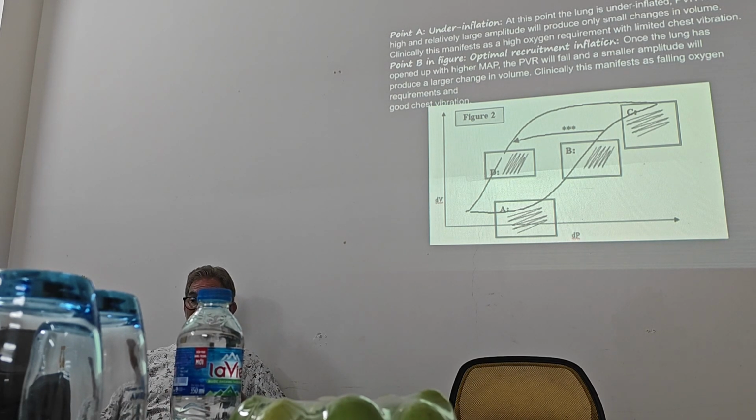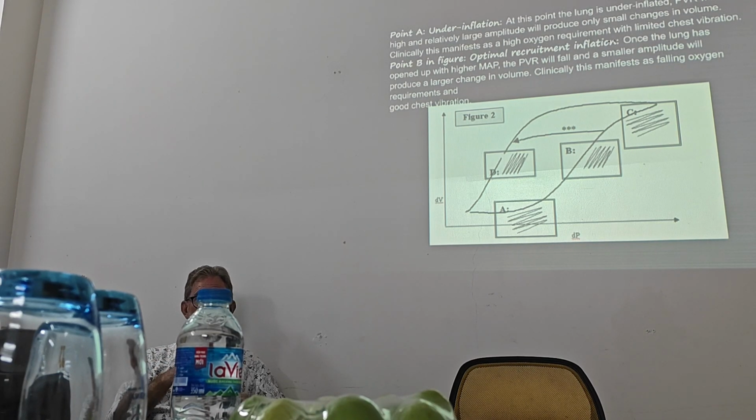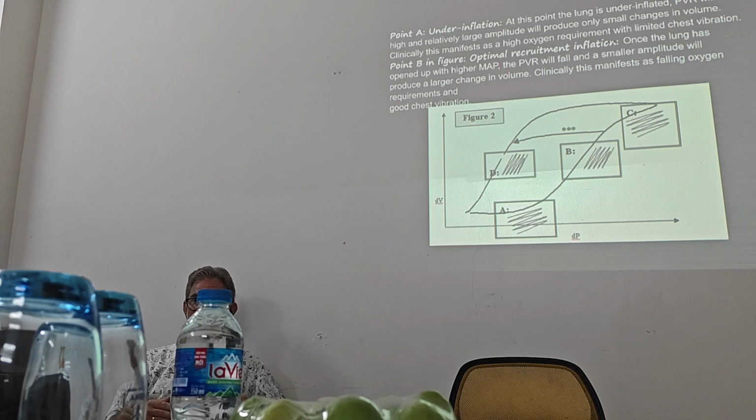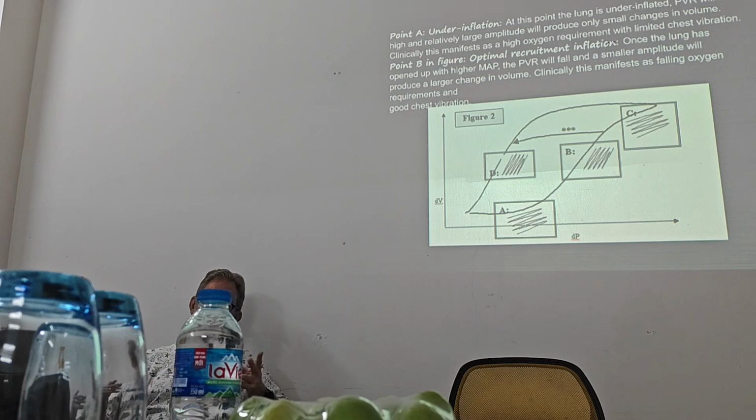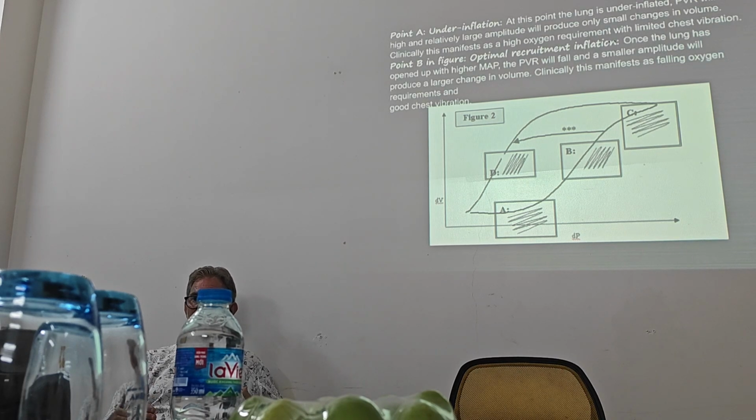And often, like with this little baby that I was talking about, we got to a mean airway pressure of 24, we were able to bring the baby back down to a mean airway pressure of 15 or 16, and the baby was still in 40% oxygen. Now, if I had just pushed the mean airway pressure from 16 up to 18 and just left it like that, the baby would not respond really well. That'd be a bit better, but I wouldn't get them down to 40%.